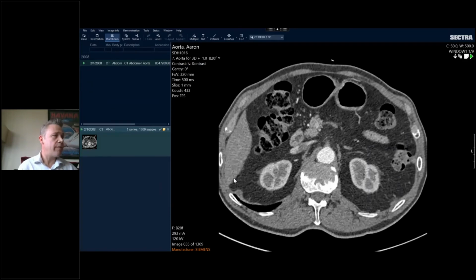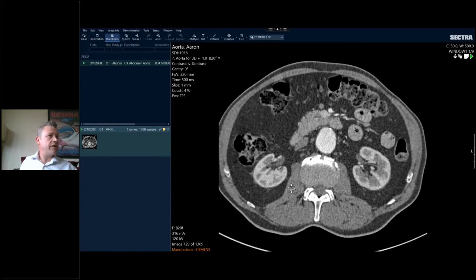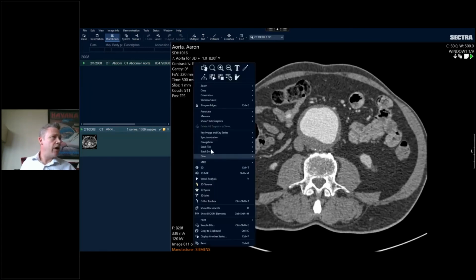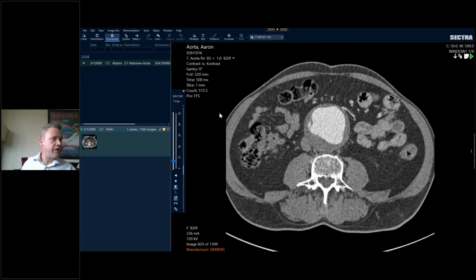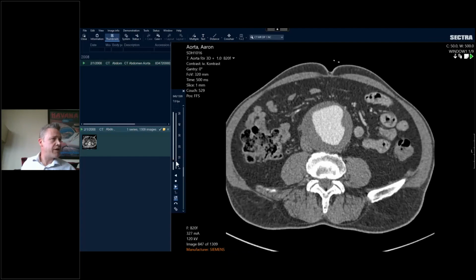There we are. Sorry, I didn't double click on there. So you can see here I can zoom in and out just like you normally can. So there's zero delays here. There's no blurring. There's no loss of pixels. Now you can see here I'm currently running it at 7 frames a second.